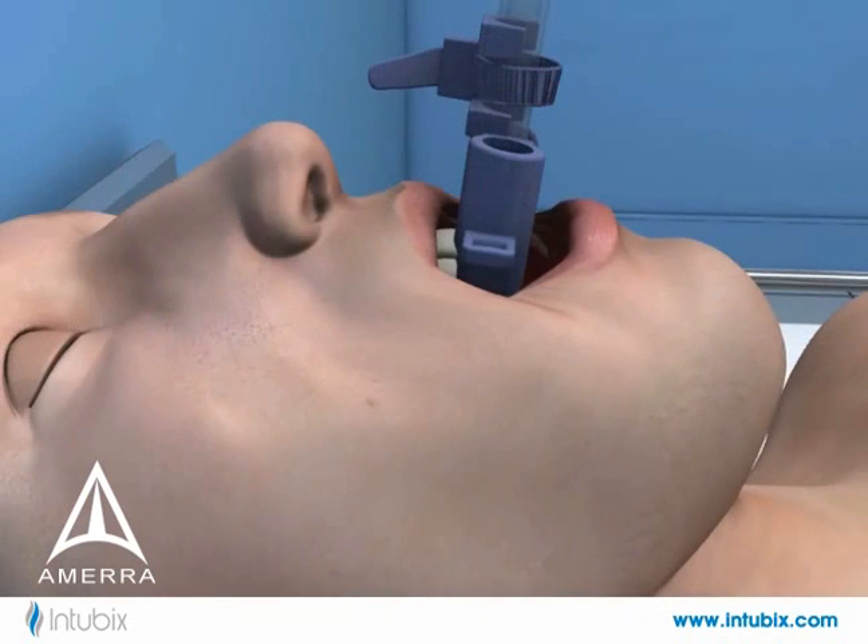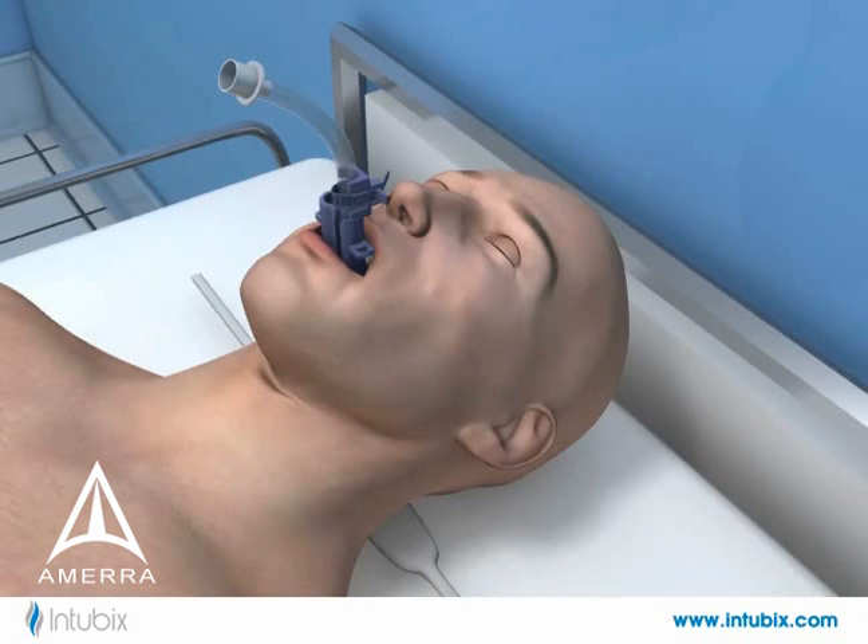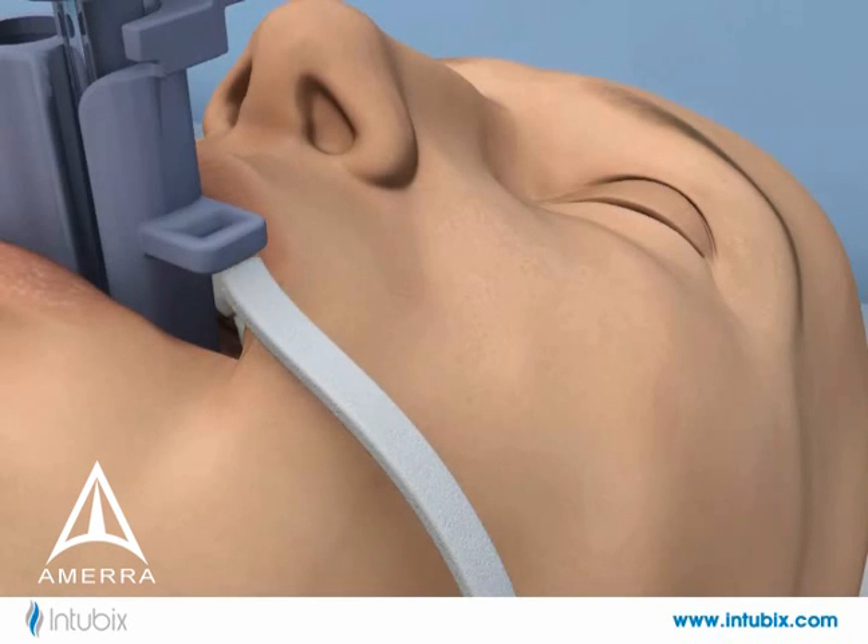The low profile bite block minimizes lip pressure and provides easy access for oral hygiene. The provided neck strap wraps around the patient's neck and secures to the device with Velcro.